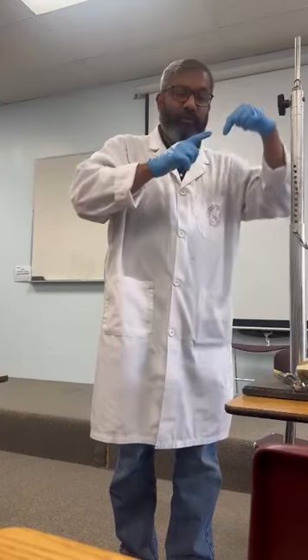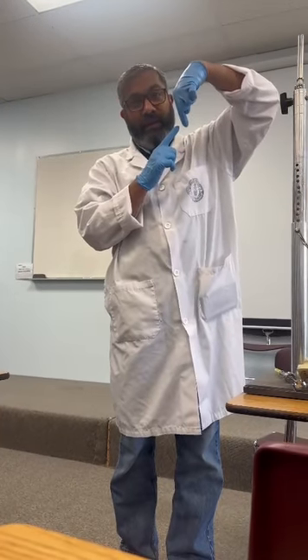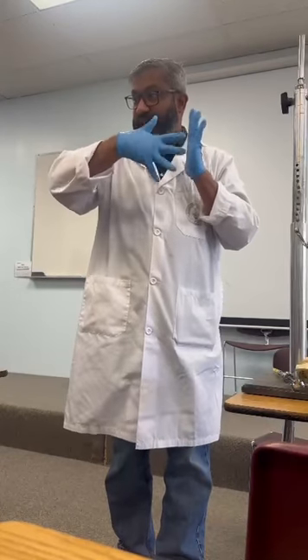So whenever we go with the needle, we have to come all the way here. We are not coming here, because if we come here, I can directly injure the nerve. That can lead to paresthesia. So that's why you have to come here. When dentists go all the way in, they feel a tug back. When they feel something is stuck, that means they are touching the bone. If they don't feel any bone, they have to change the direction. Anyway, that is the dentist's part.